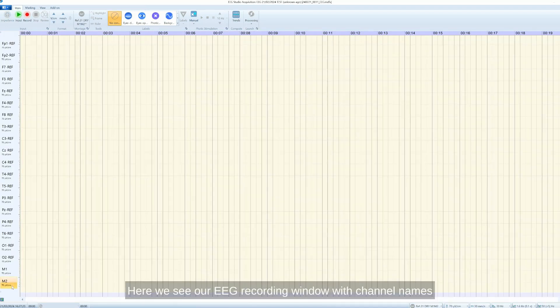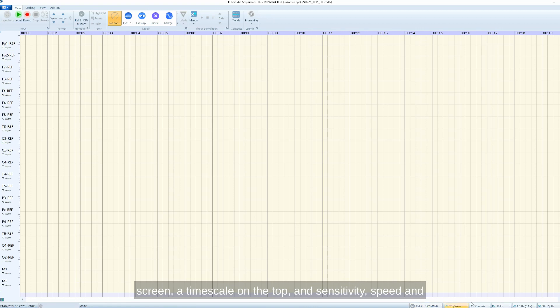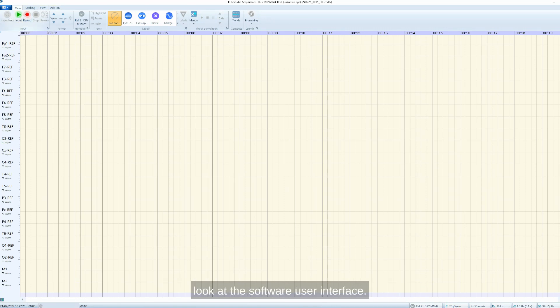Here we see our EEG recording window with channel names according to our montage on the left side of the screen, a timescale on the top and sensitivity, speed and filter parameters on the bottom in the status bar. But first, let us have a close look at the software user interface.